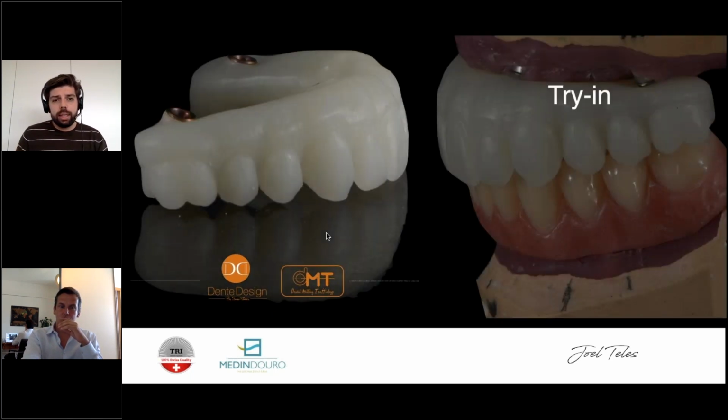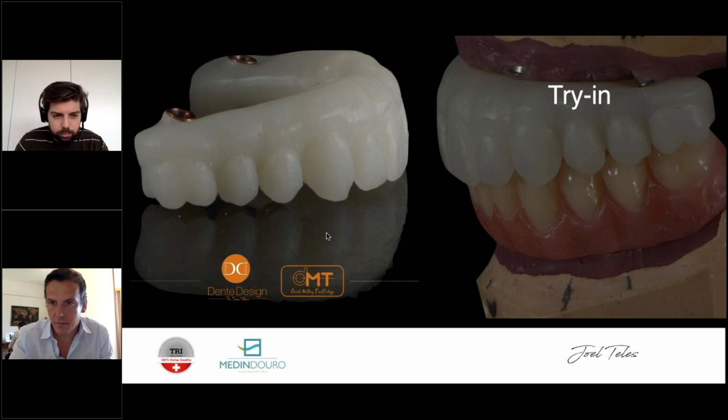Okay, so trying. Olga, you want to answer that question that we got a lot, yeah? Yes, I just try to translate a few questions from Saudi Arabia. Hi, to Dr. Salman. He is asking how much cantilever you add in the back, in palatinal? How much cantilever would you recommend in All-on-4? Yeah, in the lower jaw, sometimes it will happen that you will have 2 teeth cantilever, the 5th and the 6th. It will happen. More than that, it's almost never.